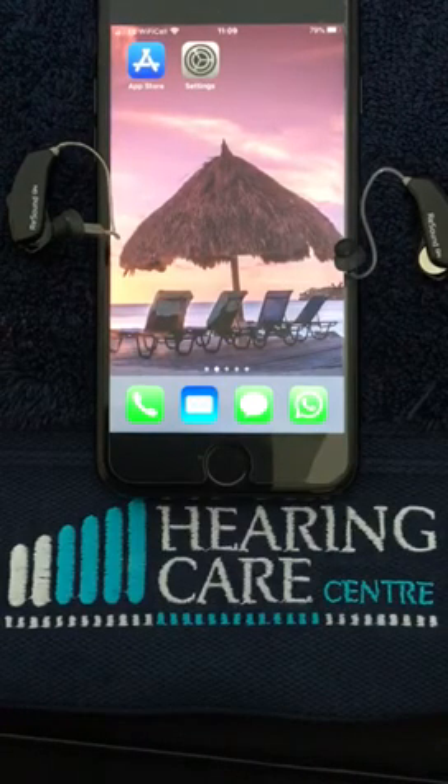Hello. This short video is to demonstrate how to download the ReSound app onto your mobile phone or your tablet.